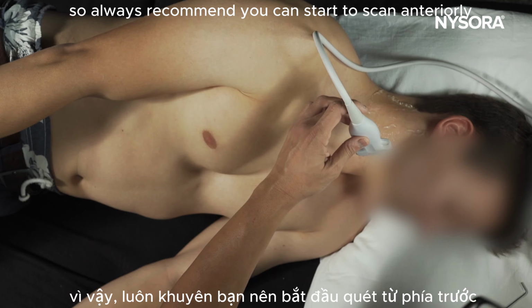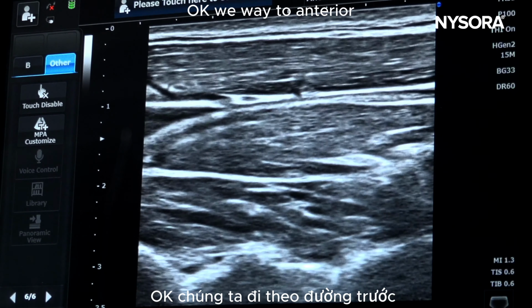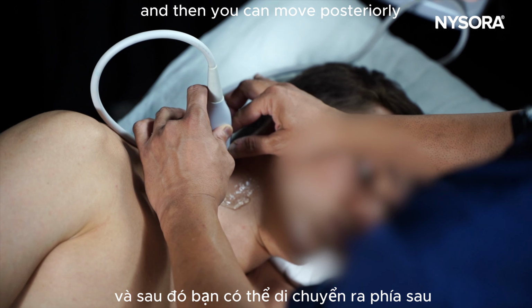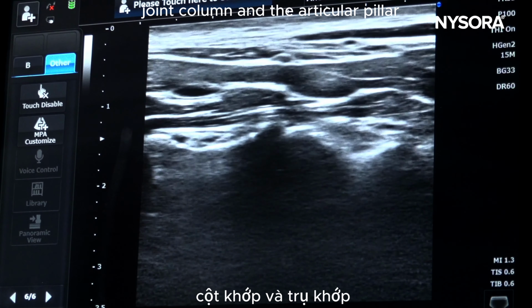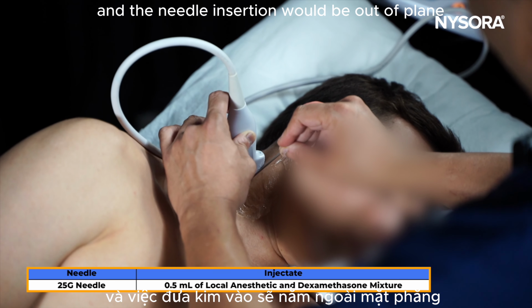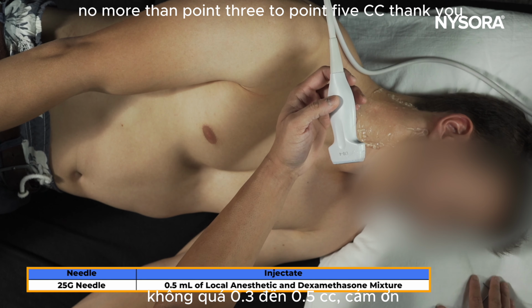So I always recommend you start to scan anteriorly with that picture of the cervical disc, and then you know, okay, you're way too anterior, you can move posteriorly and see the cervical transverse process, and then you can move posteriorly again, and this is the area of interest. This is your cervical facet joint column and the articular pillar. So you can see the peak and trough structures here, and the needle insertion would be out-of-plane or in-plane from superior to inferior. The local anesthetic and steroid mixture should be no more than 0.3 to 0.5 cc. Thank you.